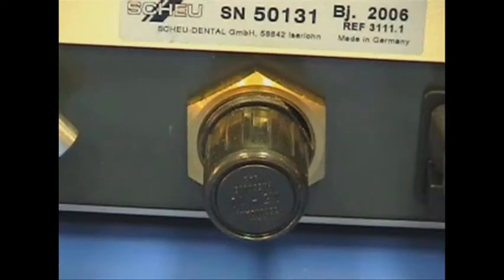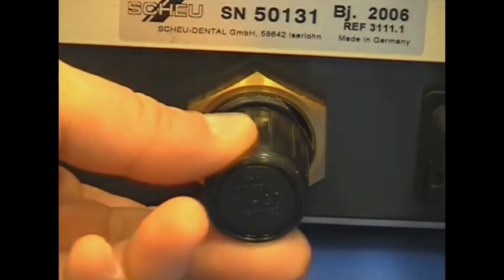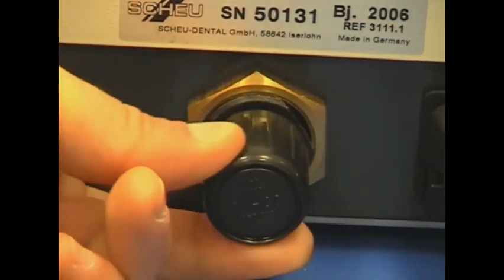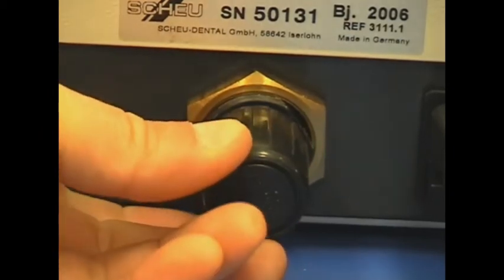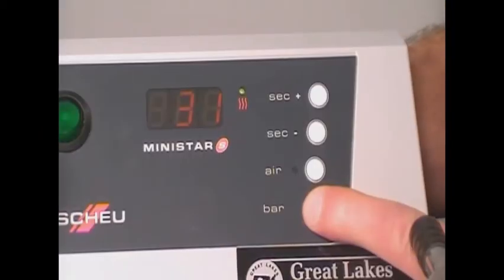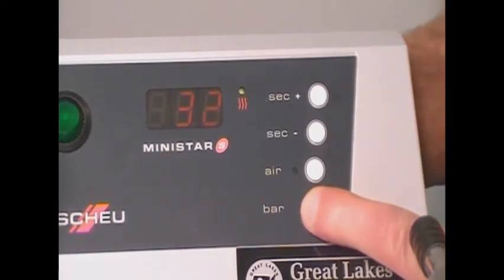To adjust the pressure, unlock the dial by pulling out on the outer ring. Rotate the dial clockwise to increase pressure, counterclockwise to decrease pressure. Do not exceed the maximum pressure of 3.2 bar. Adjusting the pressure higher than 3.2 bar could activate the safety release valve when the chamber is pressurized.